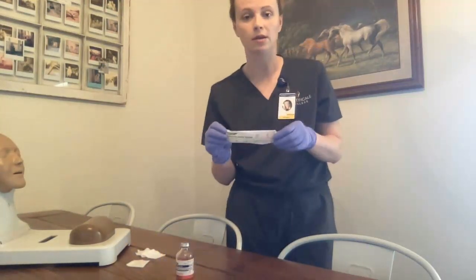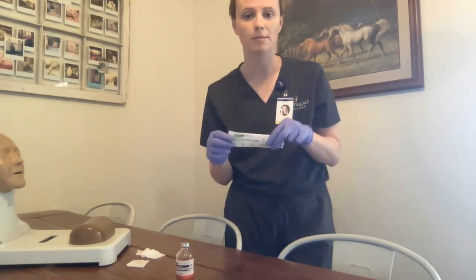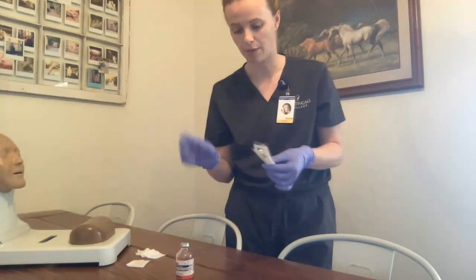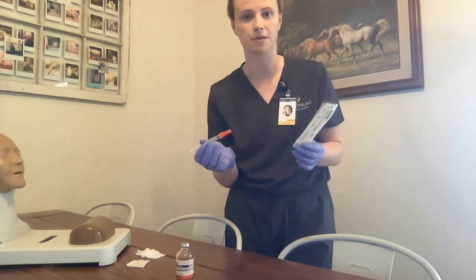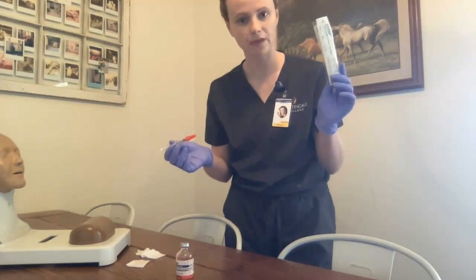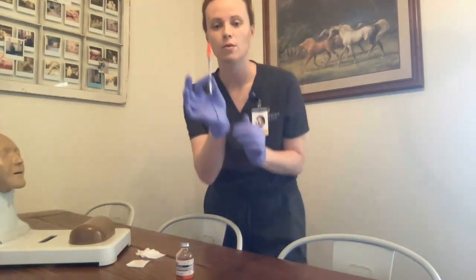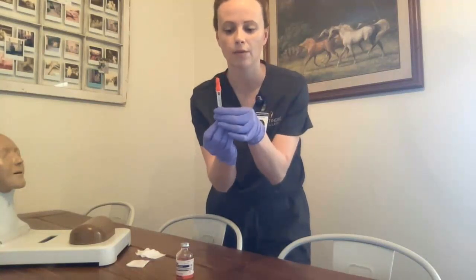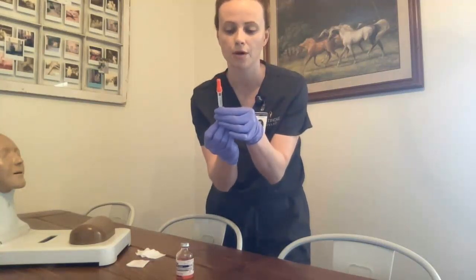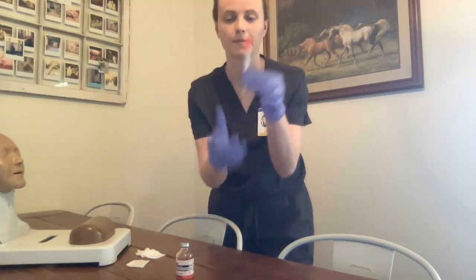The needle and syringe I am using is 29 to 30 gauge, half inch needle, one milliliter syringe. To start the preparation, I will remove the cap. Obviously this has been used for practice purposes. I'll then hold it like a pencil, needle up, cap on, and I will draw in 0.1 milliliters of air.